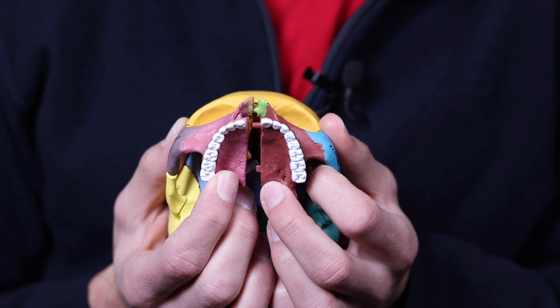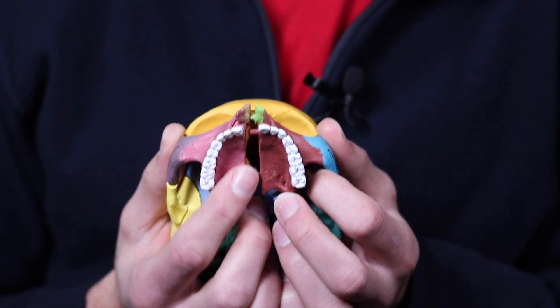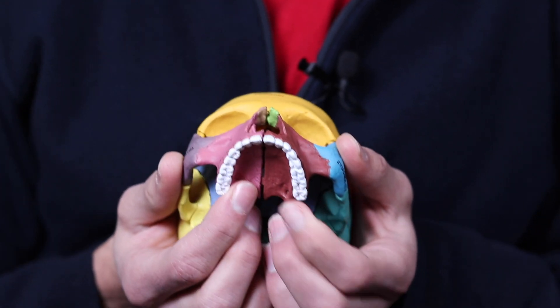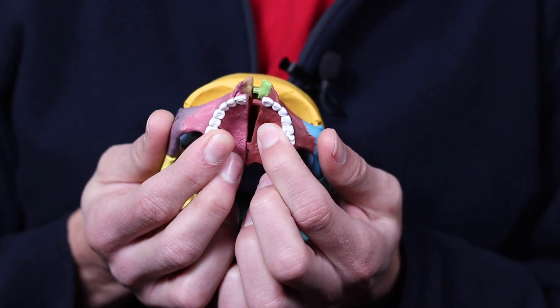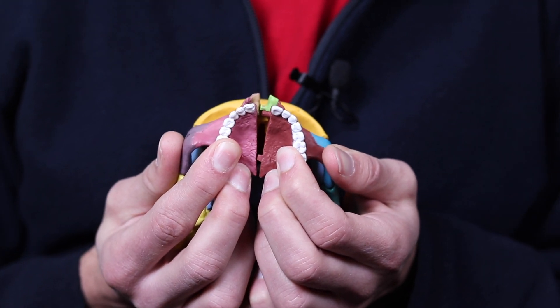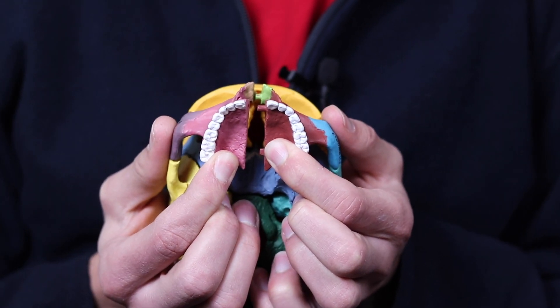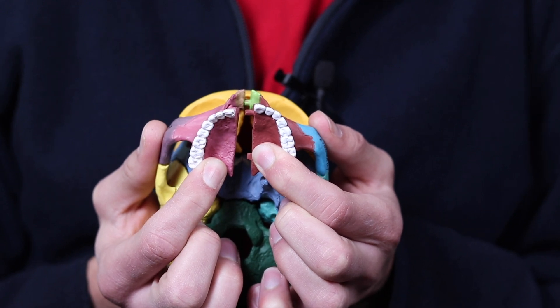I should also add that MSE is known for creating a very parallel split of the suture, whereas other MARPE devices are known for creating more of a Pac-Man type split, which is more open up front and not so much open in the back. But MSE — especially the type 2 — is known for that really parallel split where there's as much expansion at the back of the maxilla as there is at the front.